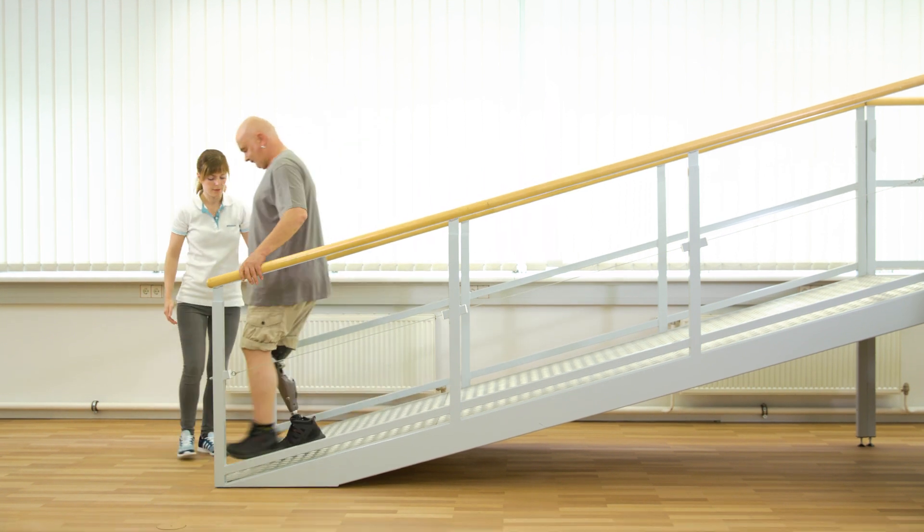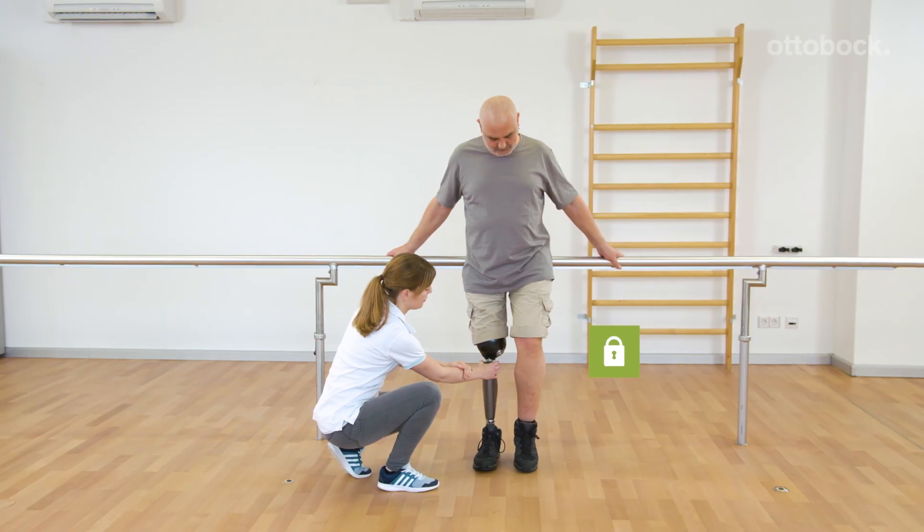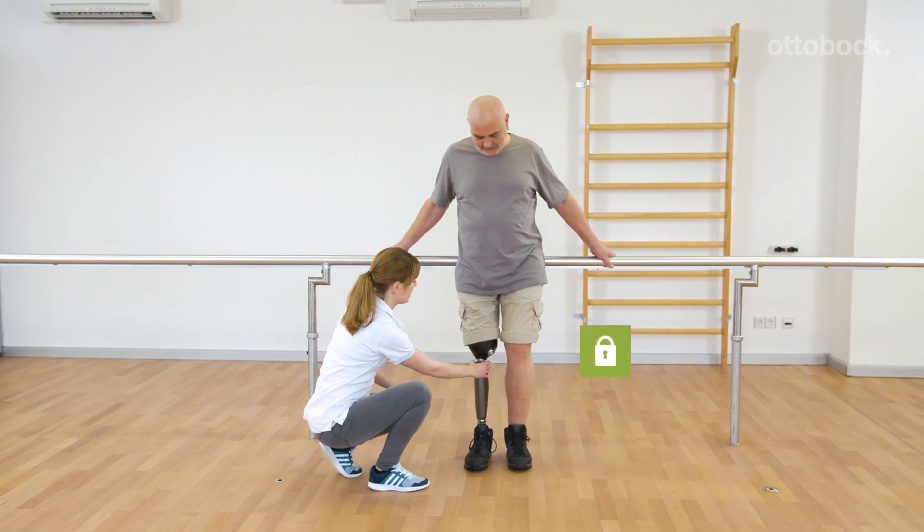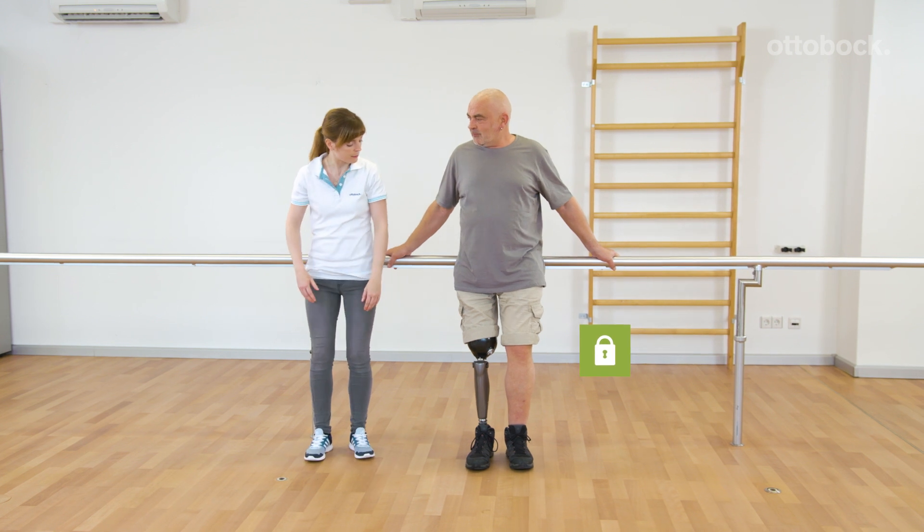Alternatively, he could take the first step with the prosthesis. The intuitive stance function provides many possibilities to relieve the contralateral leg in everyday life.